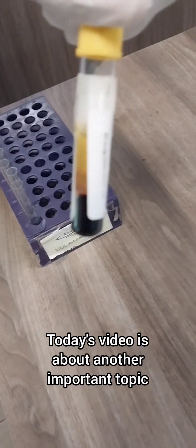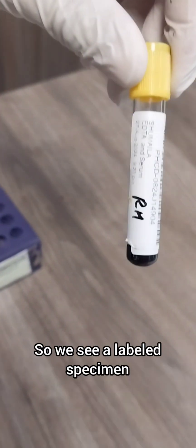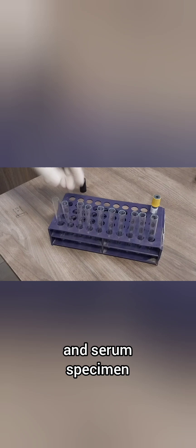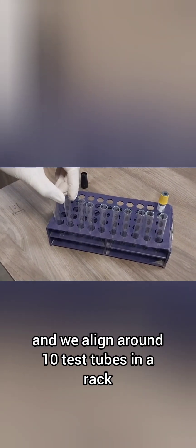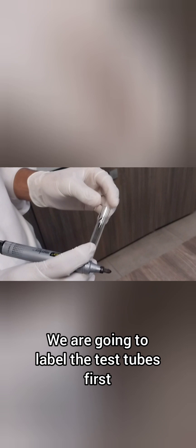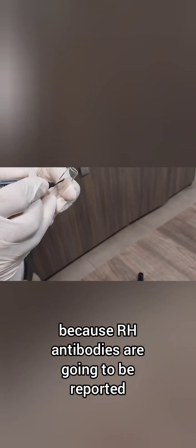Today's video is about another important topic, which is RH antibodies and how to calculate RH. We see a labeled specimen and serum specimen. We align around 10 test tubes in a rack and are going to label the test tubes first because RH antibodies are going to be reported and performed in a titer.